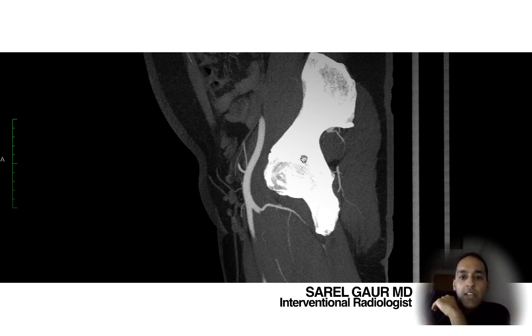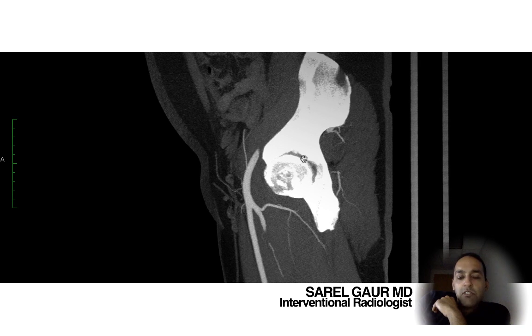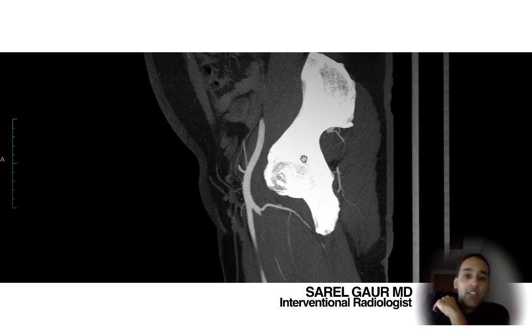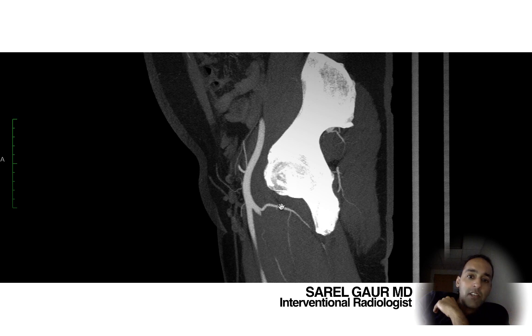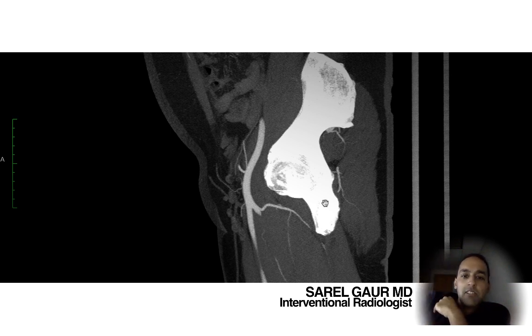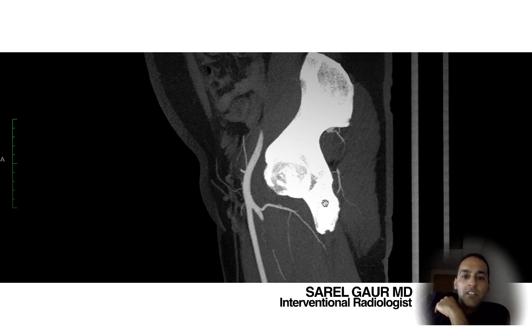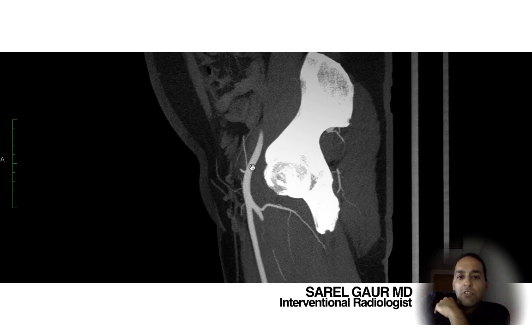What I have here are sagittal images of a CT angiogram at the level of the femoral head — the iliac bone, basically at the level of the groin. This is a sagittal MIP image. A MIP allows you to follow a vessel for a reasonable course.